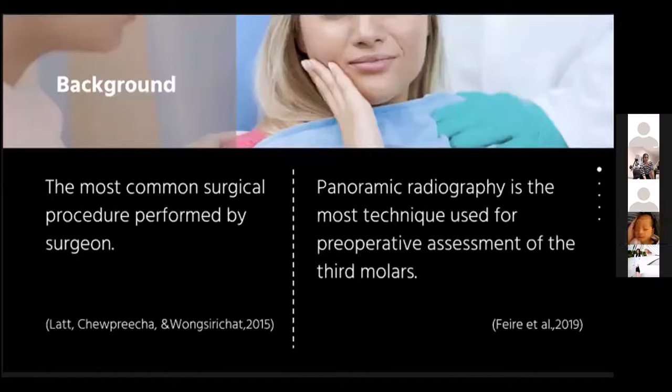The most common surgical procedure performed by the surgeon is extraction of impacted mandibular third molar. The panoramic radiograph is the most common technique used for preoperative assessment of the impacted third molar.